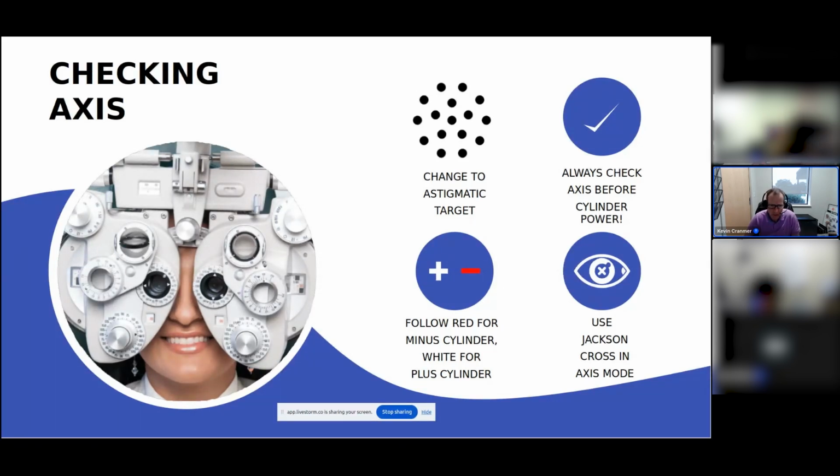You should know how to use both, but you will get used to using one versus the other. If you're a certified ophthalmic assistant or ophthalmic technician, for your testing, you'll need to know both. It's good as a professional to know how to do both, but you will probably just be using one or the other in your own practice.